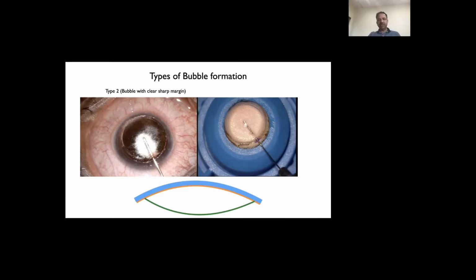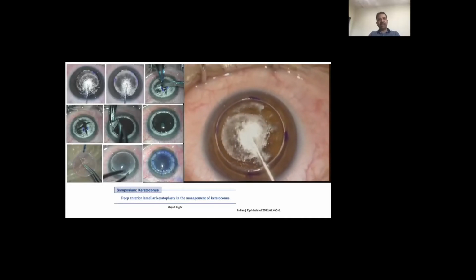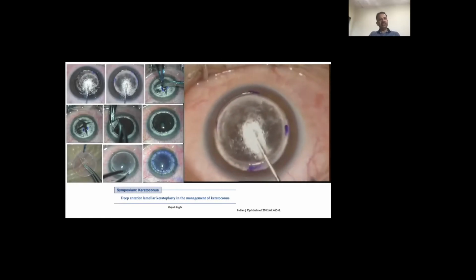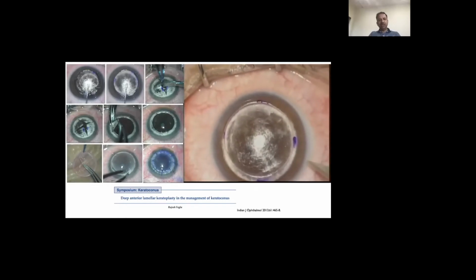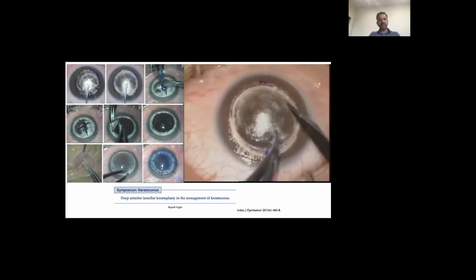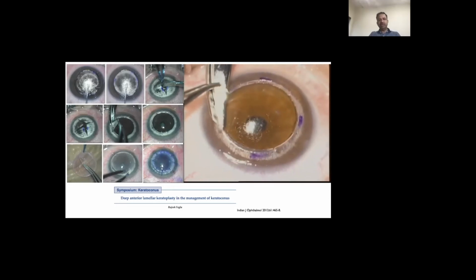Now, in terms of doing the big bubble surgery, instead of using a needle, people have started using blunt tip bottom port cannulas. You can place them very close to the Descemet membrane without the risk of perforating into the anterior chamber. Once you achieve the big bubble, the intraocular pressure rises. So you perform a paracentesis to release some aqueous to normalize the pressure, and then you deflate the bubble using a sharp knife. This is one quick rapid motion, after which you can split the overlying residual cornea into 4 quadrants, excise the residual cornea, and punch out a donor corneal button.